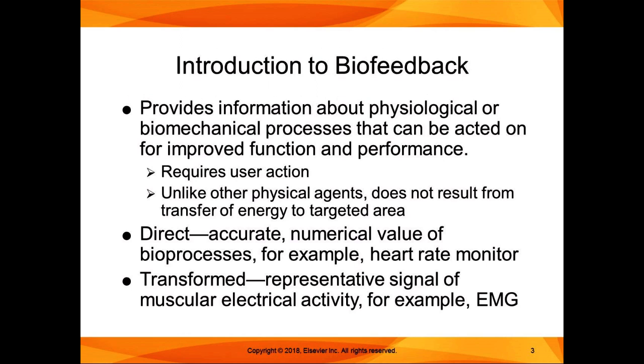So, biofeedback as a whole is something that provides information about physiological or biomechanical processes that can be acted on to improve function and performance. So it requires action by the patient, by the user of the biofeedback. And unlike other physical agents, it doesn't transfer energy to the targeted area. All it's doing is giving that patient either a visual or an auditory or some sort of feedback that can allow them to change something to improve their performance.